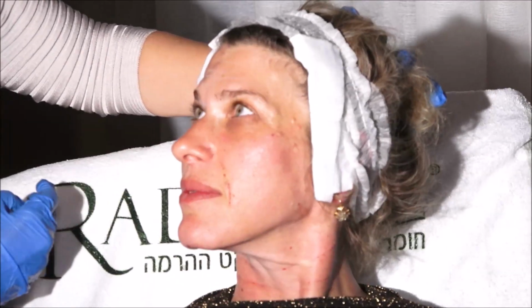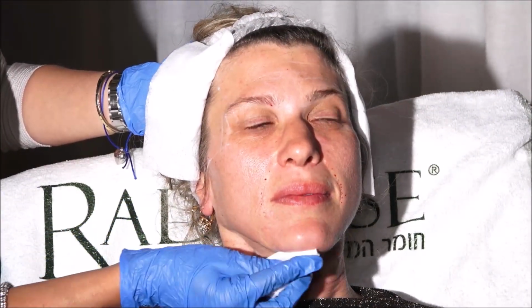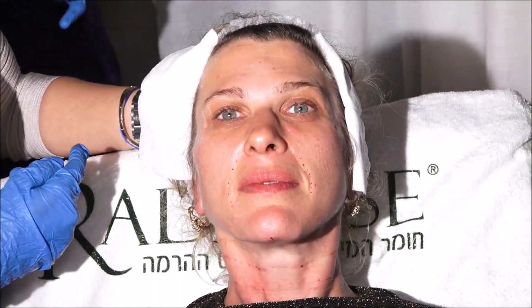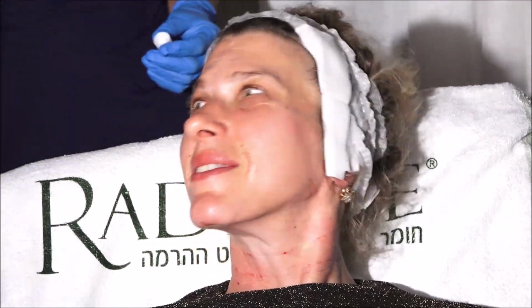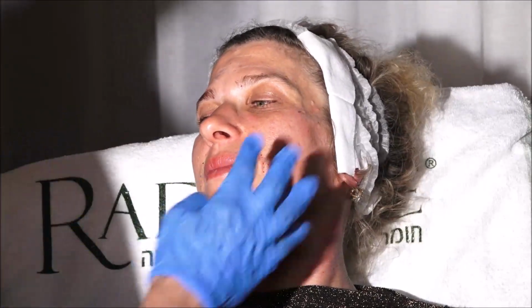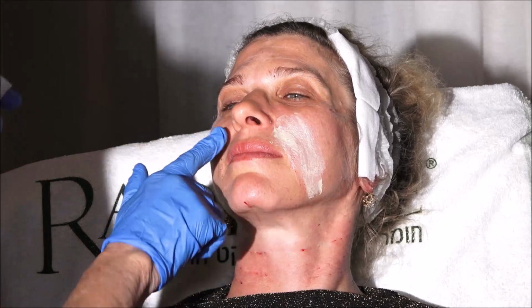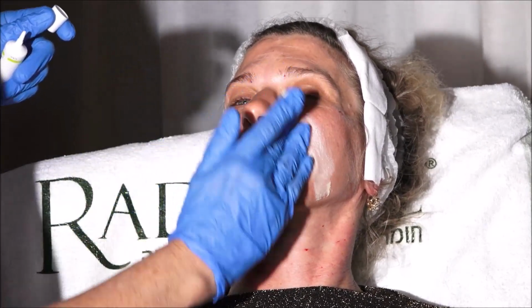So this is her face treated in both sides. Of course, this side has more edema because the Radiesse has the edema right after. And you don't see so much laxity anymore immediately after, but we imagine that this will be better. A little bit of this. And in this one, you can see better than in that one. Yes. Yeah, the colors, right? Yes. You can see much better.